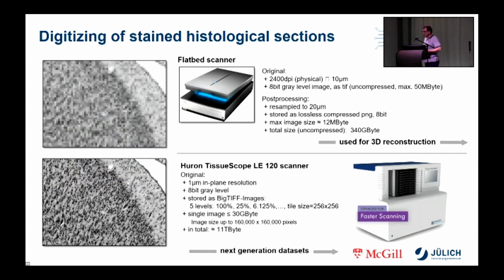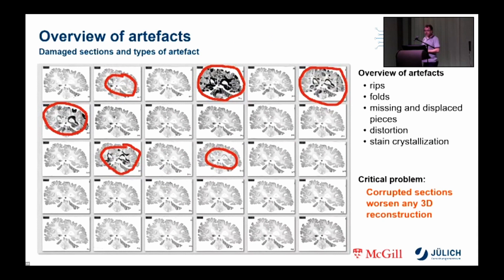Although the histological processing steps were carried out with a lot of know-how, the digitized histological sections show a large number of artifacts. One of the great difficulties and challenges is that there is a wide range of types of artifacts with varying degrees of severity, distribution and quantity. This makes any fully automatic processing a great challenge, but most of the artifacts must be repaired to achieve a good 3D reconstruction of the brain.